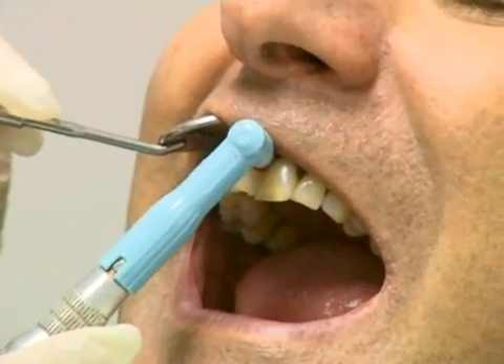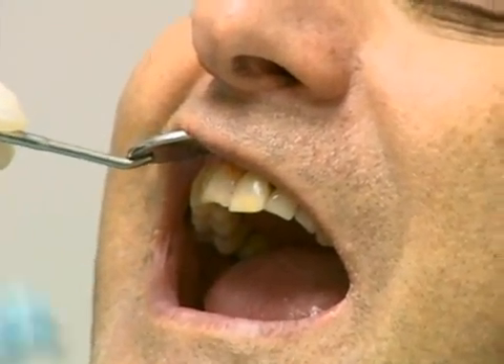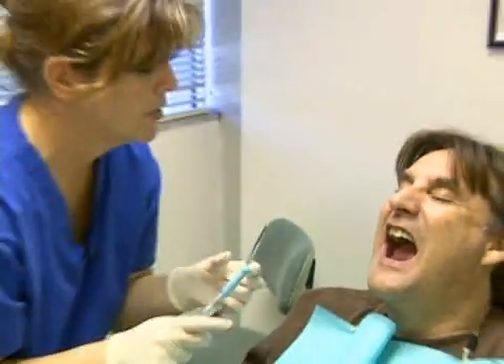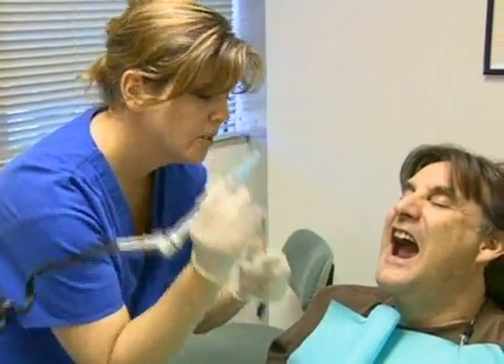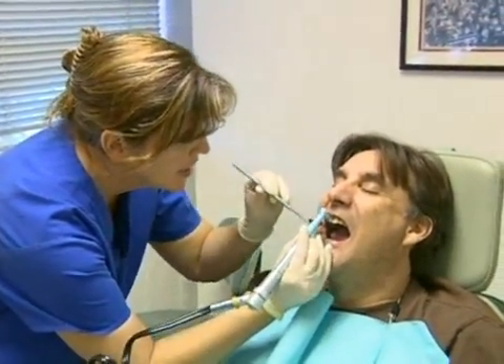Then do another swipe on one side and another swipe on the other. The object of the game is to make sure you get everything covering the whole tooth. It's really important that you establish a firm hold on there by putting your pinky just so everything is really tight.